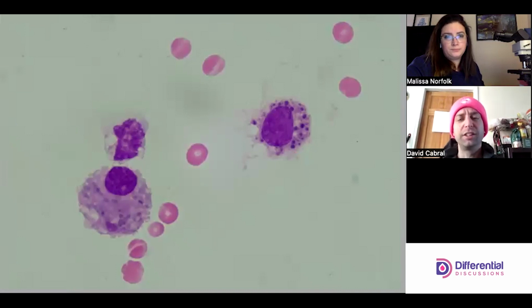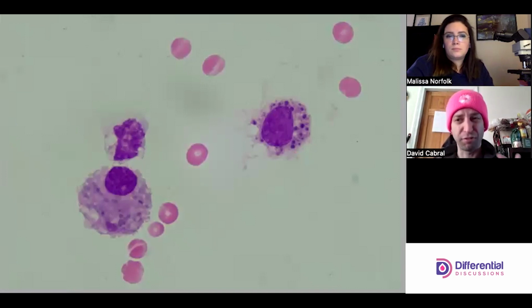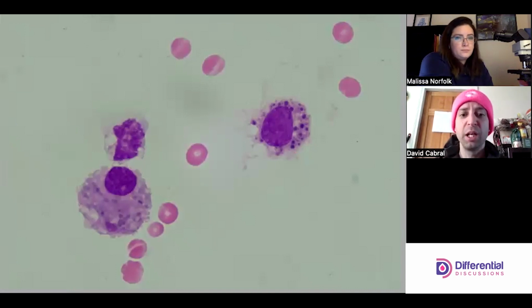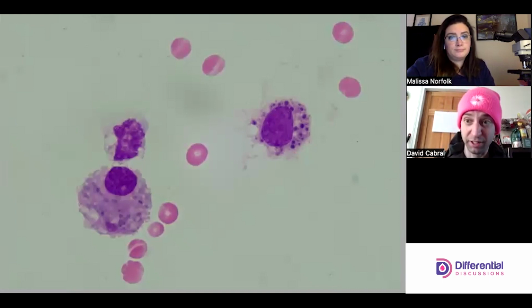So this particular individual has red cells bleeding into the tissue space here in the pleural fluid. It could also just be inflammatory in nature. When you have increased capillary permeability, it's not uncommon for red cells to make it in there. But red cells don't belong there. They will be phagocytized, which we have seen evidence of, right?